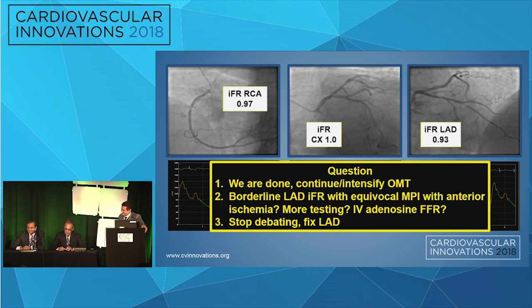Now, having said that, I am exceptionally uncomfortable with a lot of the non-invasive nuclear testing that we get. So this is an adjunct. So I would have treated the LAD, or if I got this, FFR the LAD. Yeah, and I think that, go ahead.